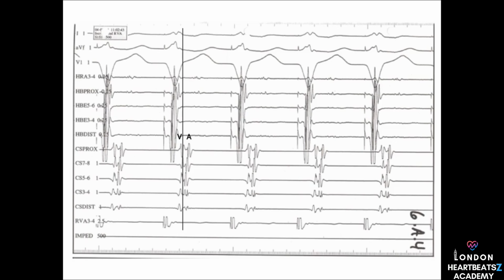So it's forced to take the scenic route. Exactly. Now, figure 6A4, this is showing straight ventricular pacing. We're just delivering a series of paced beats to the ventricles. Okay, and what are we seeing?